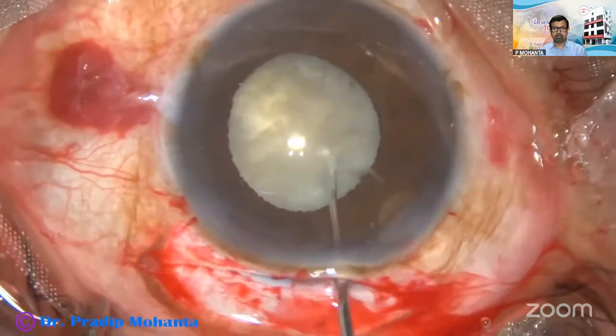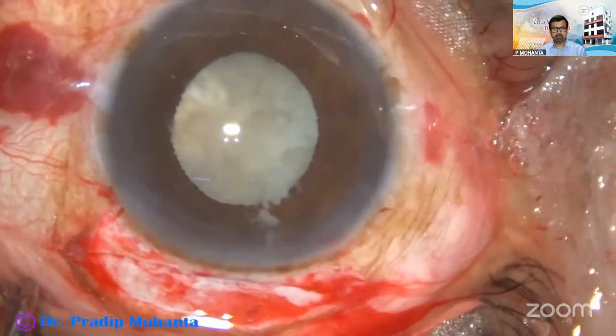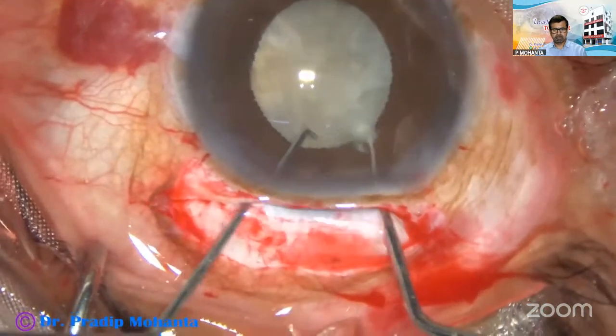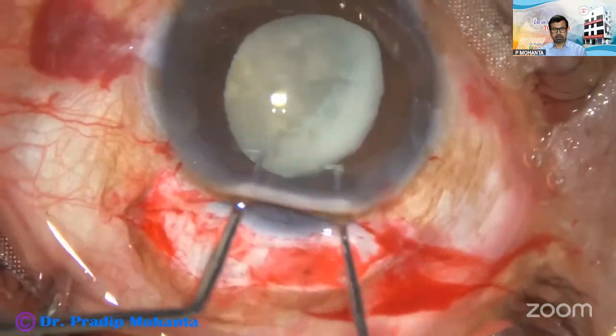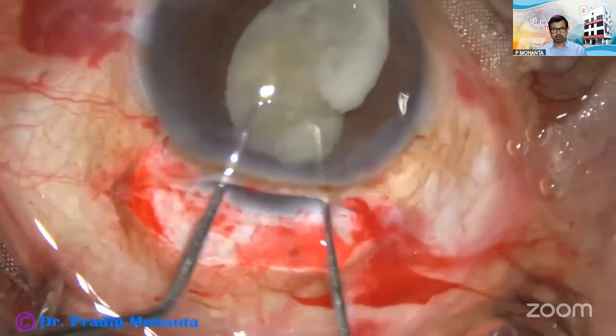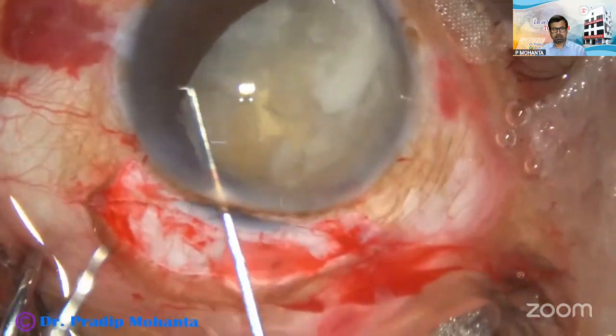Pupil is becoming small, but once we convert to SICS, that is much safer even if the pupil becomes small. The nucleus is prolapsed into the anterior chamber.